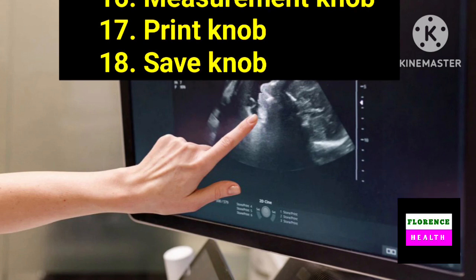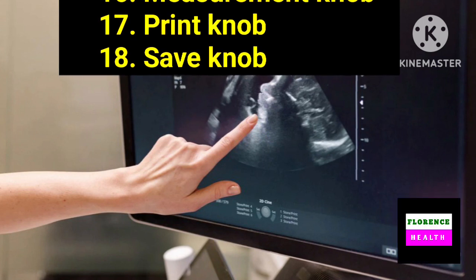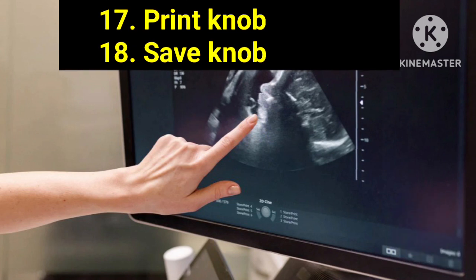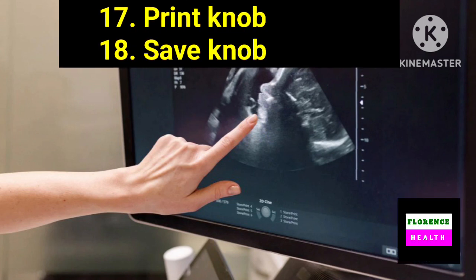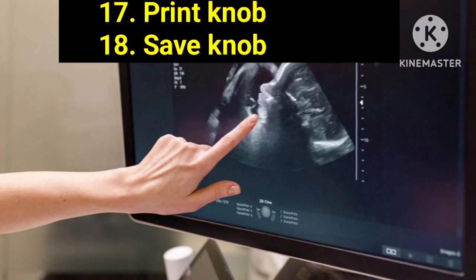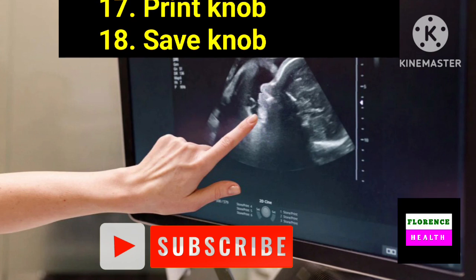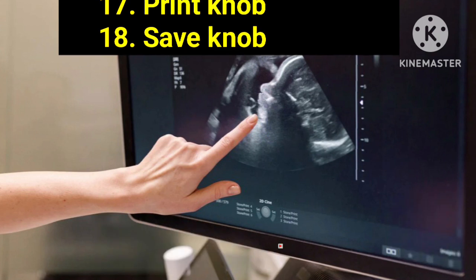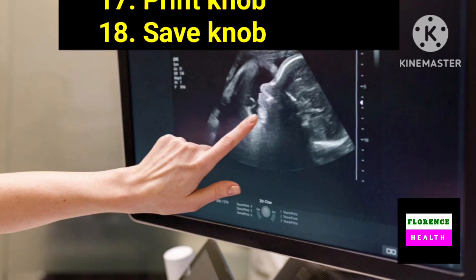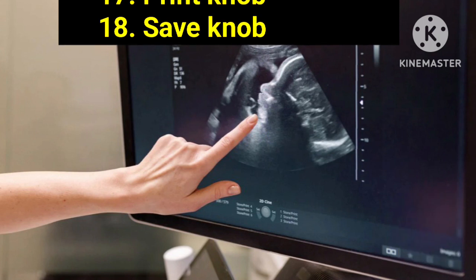So base striking angle for color Doppler is less than 60 degree and worst striking angle for color Doppler is exactly 90 degree. But in case of grayscale, base striking angle is exactly 90 degree. Remember, what do you mean by striking angle or angle of insonation? It is the angle between the ultrasound beam and targeted object.